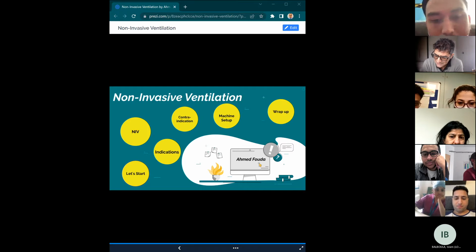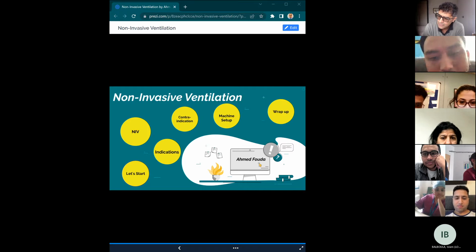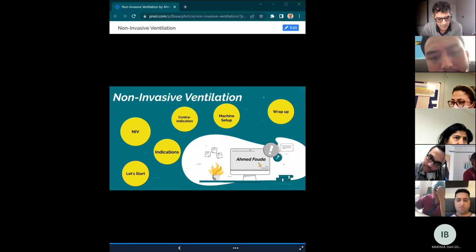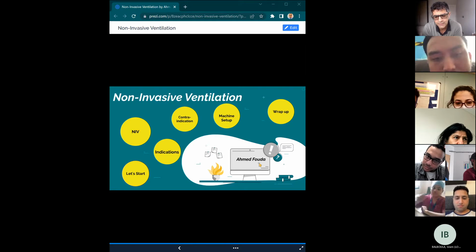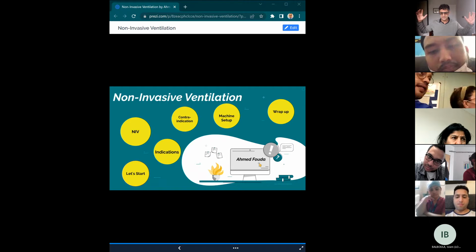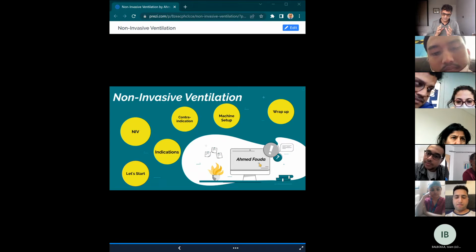Okay, so not a physiological change. You're talking about one of the problems with it. That's not really an issue with BiPAP. You can breathe on the BiPAP. So BiPAP is just having a PEEP at 5, and then increasing the PEEP to 15 or 20, and then dropping down to a smaller PEEP.